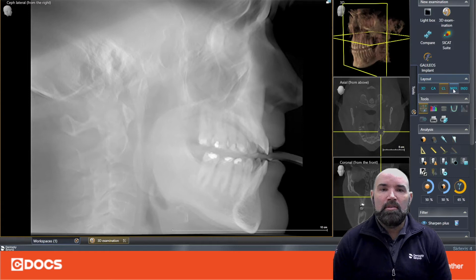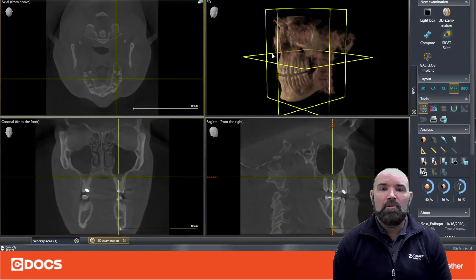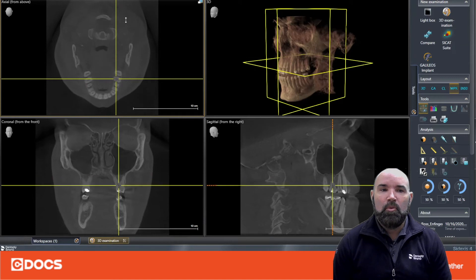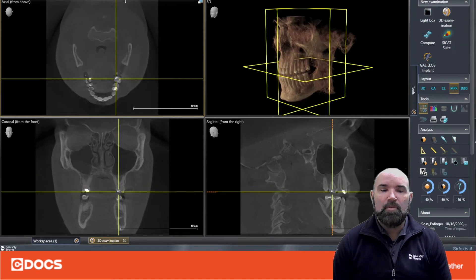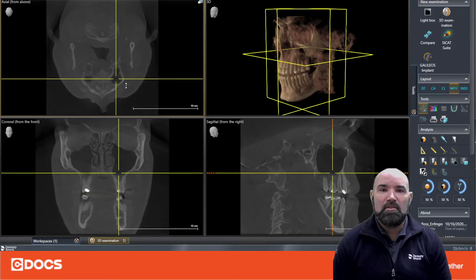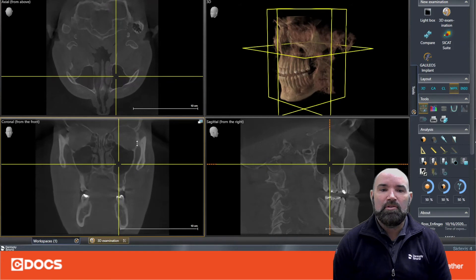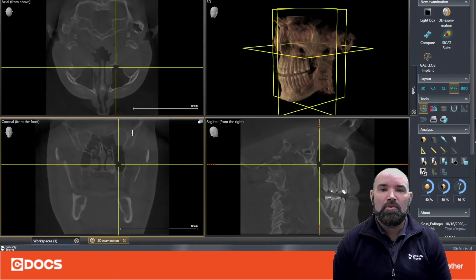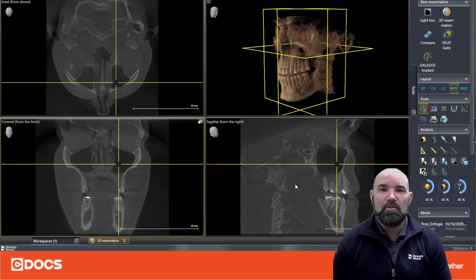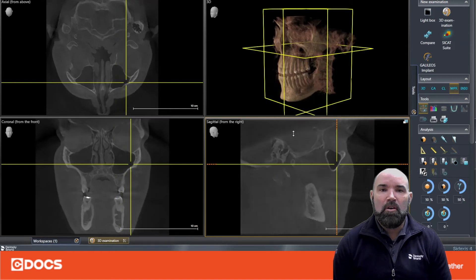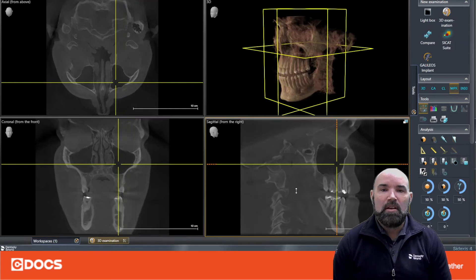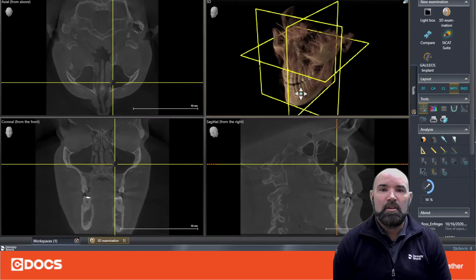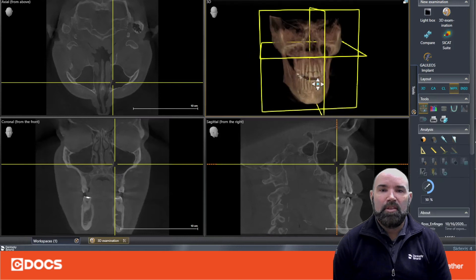Next up is our MPR or radiology view. You'll notice most conspicuously we don't have an inspection window like we do in our 2D pano view. What we do have is different slices of our volume: we have an axial slice, a coronal slice, and a sagittal slice. This MPR view allows us to section through our scan very efficiently and look for things like pathology.